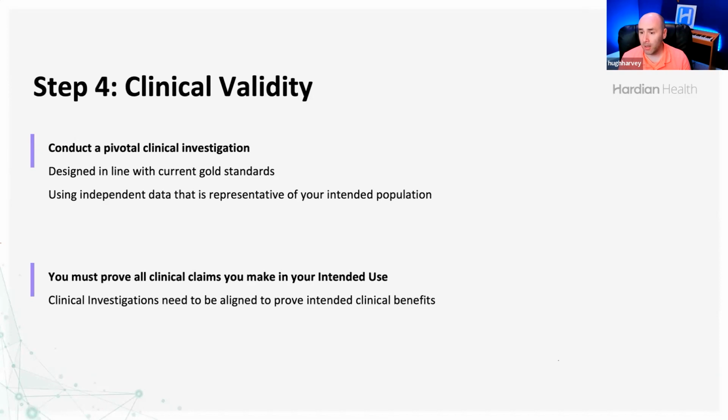Another question from Asaf Niaz: does a software web app recording health and well-being questionnaires such as IPAQ or Audit-C need to be classed as SaMD? It will depend on your intended use. If you are just recording outputs from a questionnaire, you might not be a medical device, but then that might not be a very useful app if you're just recording outputs. If your app is processing that data and making some kind of clinical decision support or triage, then it would likely be a medical device. So it really depends on what you define as your intended use.